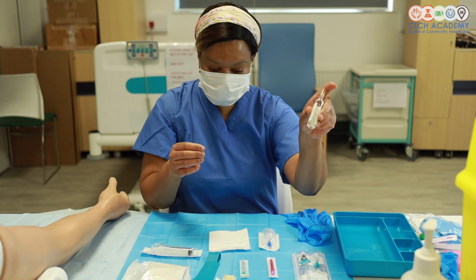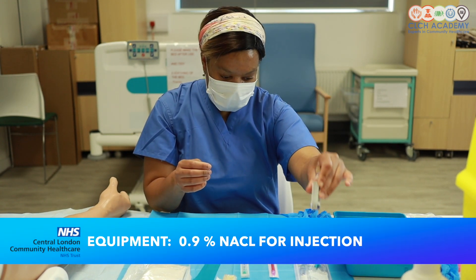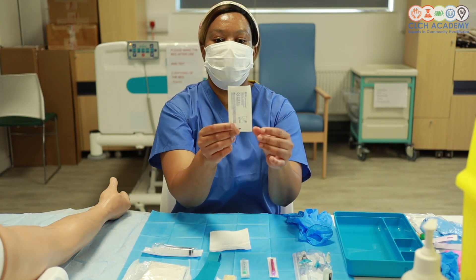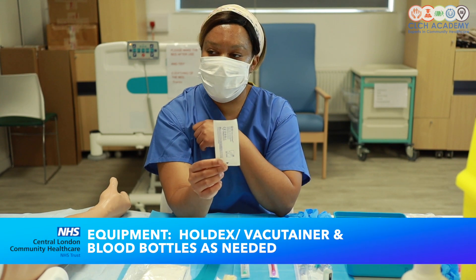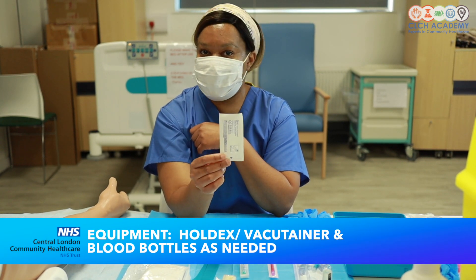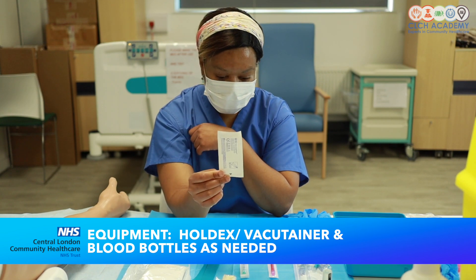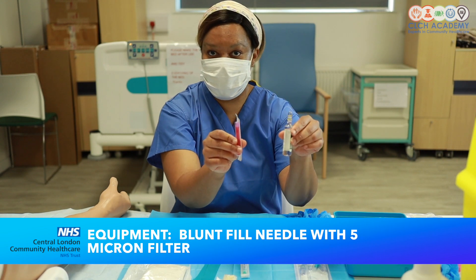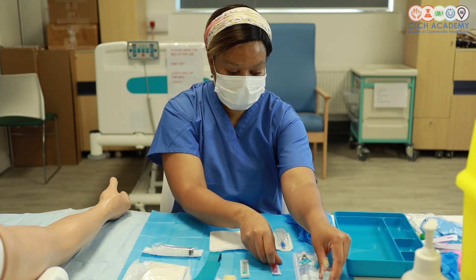I've also got some saline 10 ml for flushing my line once the cannula has been put in. I've also got my holdex that I will use to connect to the cannula if I need to collect blood at the same time as inserting the cannula. I've also got some filter needles as I'm using a glass ampule, and I'll explain the rationale for that a little bit later.